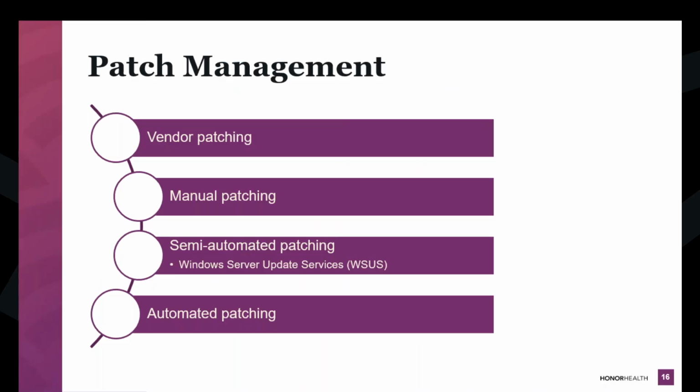Semi-automated patching. So semi-automated patching for us is patching with a WSUS server. So what we do is we have our medical devices, Windows devices, we check them into a WSUS server. So they now communicate with the server. They say to the server, hey, I'm here. This is what's currently going on. This is my operating system. These are the patches that are installed on me right now. And then the server says, okay, this is what I think you need, right? And at that point, our team validates with the manufacturer and says, are these patches approved to be installed? If so, we approve them on the server.